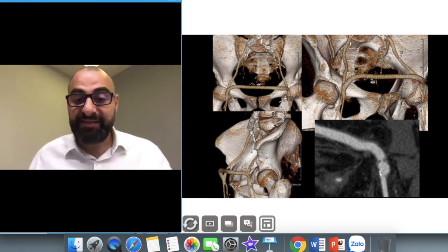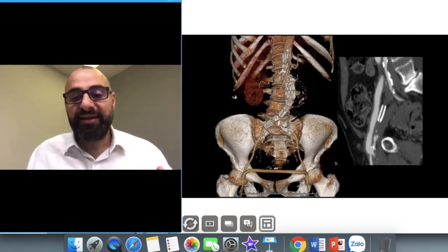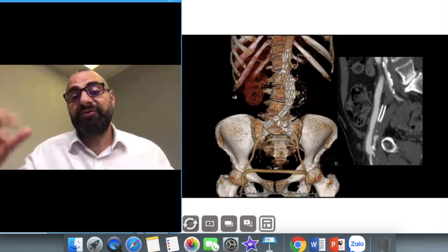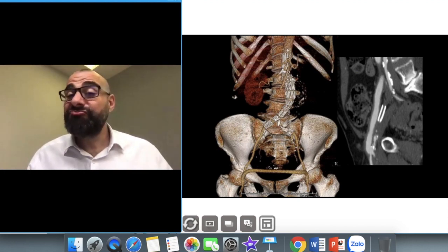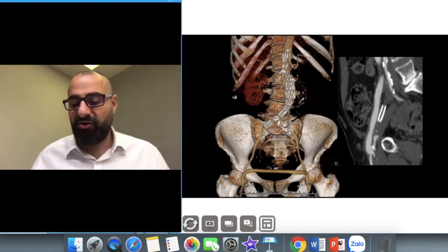In the same patient, there was also an endoluminal stent, and with this stent we found a ruptured vessel posteriorly with a pseudoaneurysm. This really demonstrates how allowing time for contrast to move and circulate accordingly reveals important pathology.